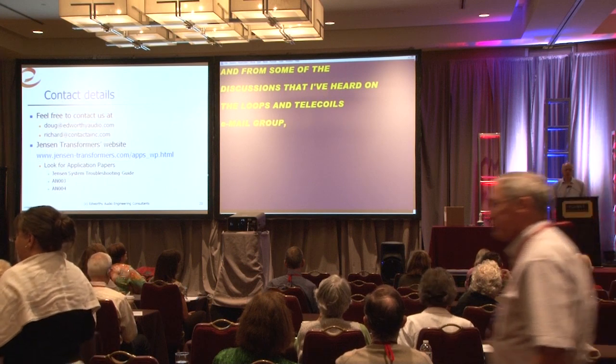It's possible that some audiologists are setting the hearing aids too sensitive in the telecoil position, and it's possible that this extra sensitivity is causing people to think that there is more noise problem than there actually is. Now, there is a standard for the setting of the telecoil sensitivities, but it may be that some audiologists either are not fully aware of the standard or not sure how to adjust the telecoil to that particular sensitivity. So there's two sides to every coin. There is the level of noise, but there's also the sensitivity of the hearing aid to that noise. And if a hearing aid is set up correctly, our experience in the UK and Scandinavia is that environmental magnetic noise is not generally much of a problem.